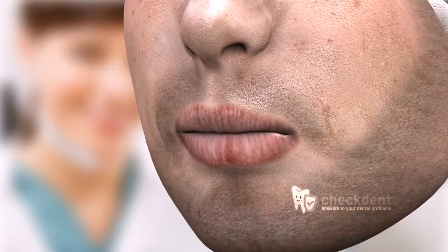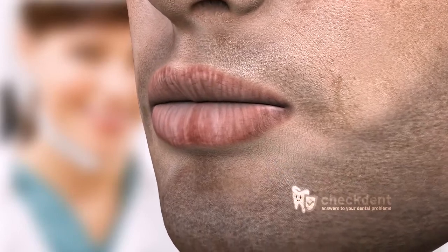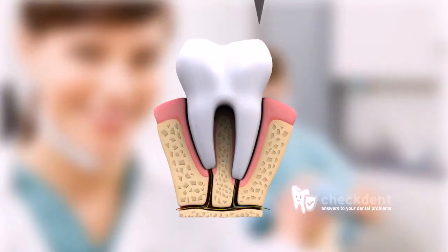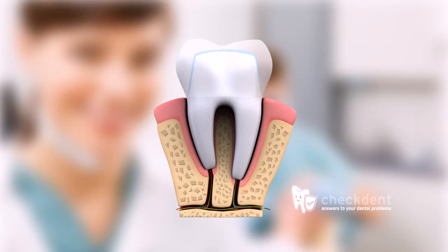Differences between dentists do exist with regard to the fabrication of crowns from the functional point of view. This is why some crowns last for 30 years or more, whereas some last for only a few years. A crucial factor for durability is the manner in which the tooth was ground or cut by the dentist. A quick and easy way is the so-called tangential abrasion. The tooth is simply beveled.